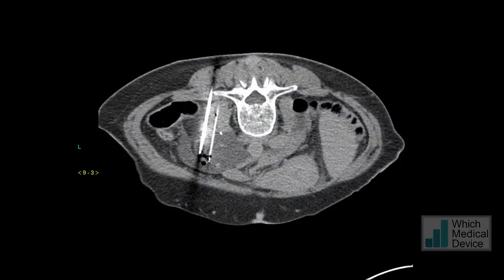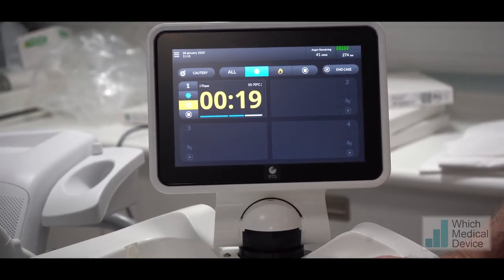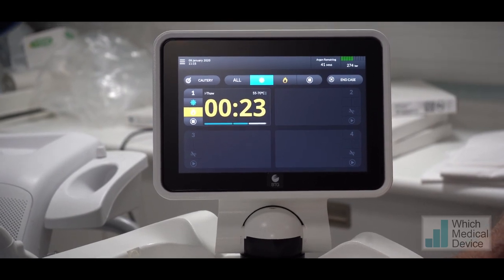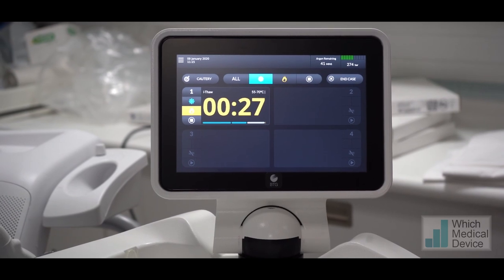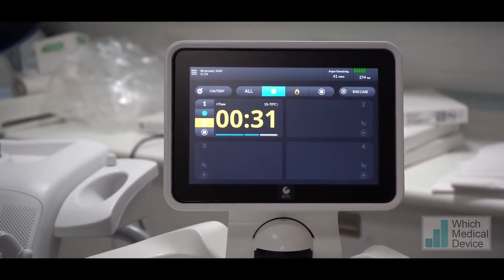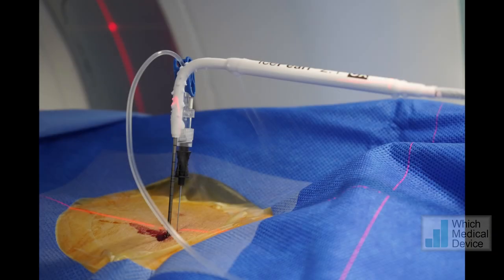Partway through the ablation you can see the ice ball starting to form, seen as a low attenuation area within the kidney. There's also a small amount of gas from the hydrodisection. We then allow this to thaw — passively for about nine minutes and actively for about a minute. This is the active thawing going on at the moment, and once thawed we then perform cryoablation a second time.